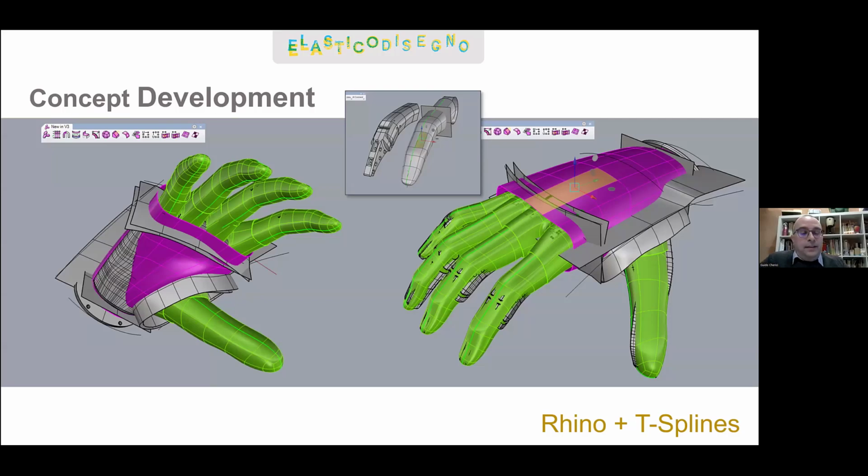When we started developing this hand in 3D, it was 2018. So sub-D within Rhino was still not here, and so we used T-splines. Today we would have used the sub-D within Rhino. And so with T-splines and sub-D modeling, we were able to fit our skin onto the mechanics, while at the same time working with the engineers to optimize some components placement to be able to achieve and retain these human proportions they were looking for.